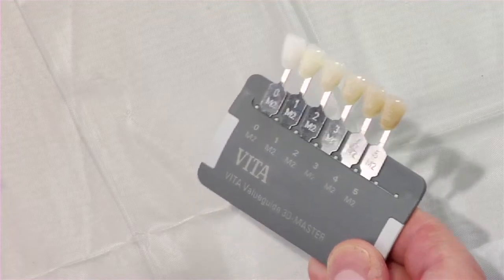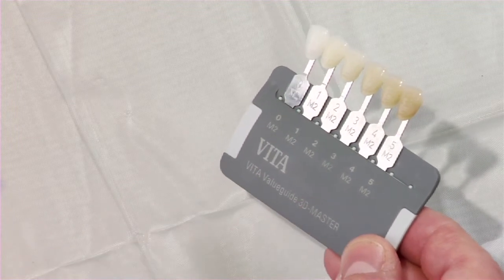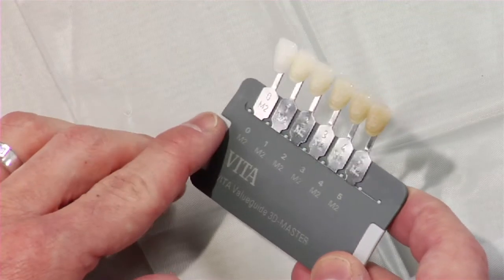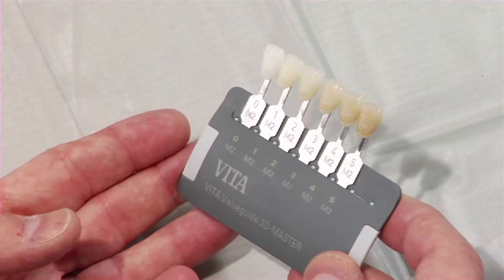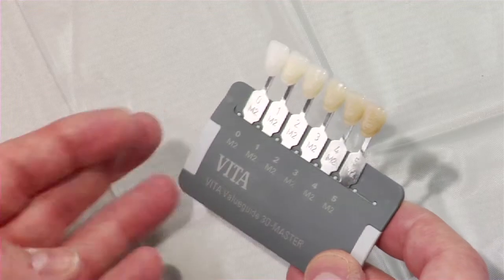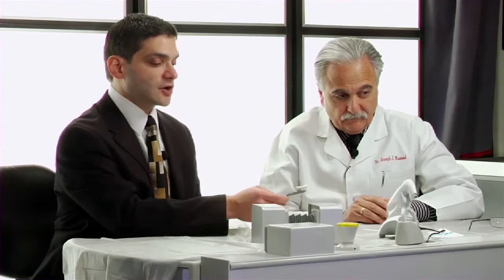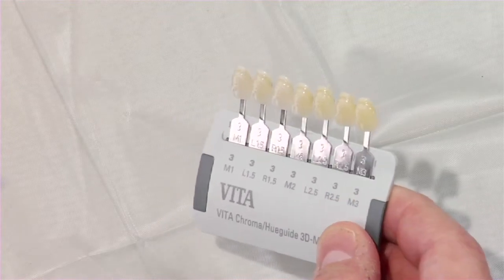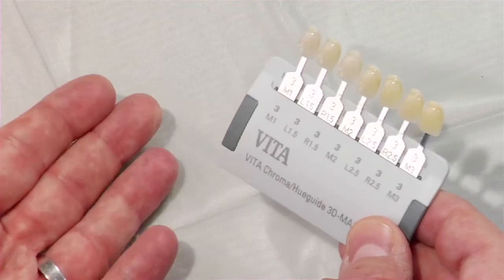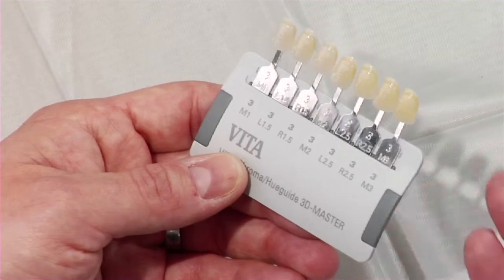The first guide is the value guide. For those who have used 3D Master, you'll notice all five value groups on one small shade tab — the middle chroma group, zero M2 to five M2. You put it up to the patient's mouth and ask yourself: is it closest to group 5, 4, 3, 2, 1, or 0 in lightness or darkness? Once you know which group you're in, you go back to the holder, pick out that individual group, and in a second step — no longer three steps — you specifically pick the shade and you're done.